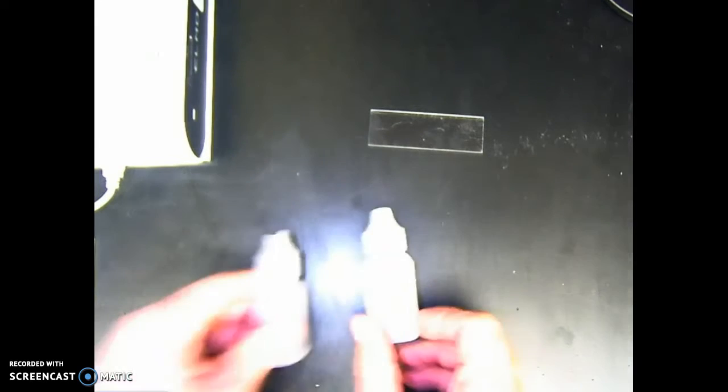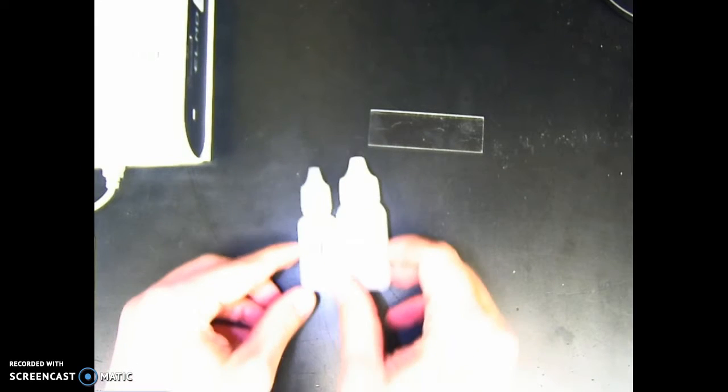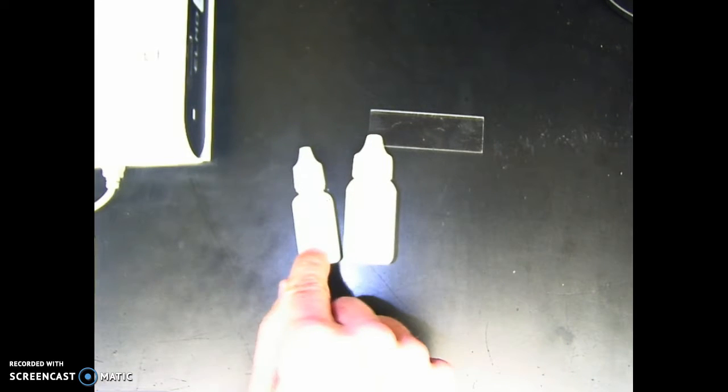What you're given for the people is not their blood type. You're given the bottles that you can get to achieve their blood type. There is a list that says big bottle or large bottle, and they are numbered. Here, for example, is the size difference between the two bottles. I'm not sure if the camera's going to pick this up, but here we have the large bottle, and here we have the small bottle.